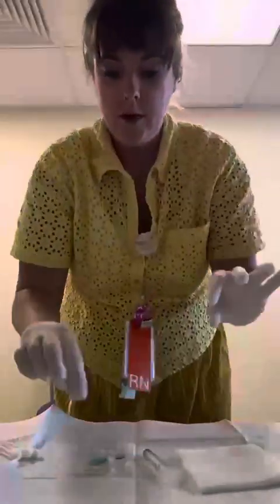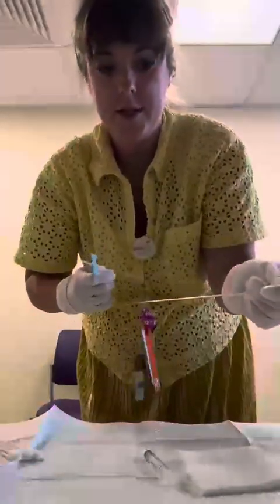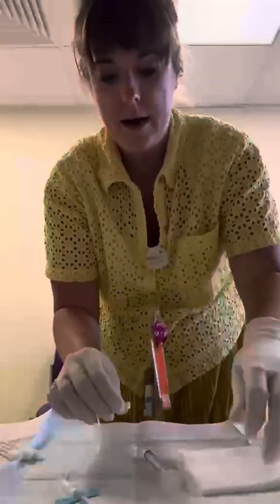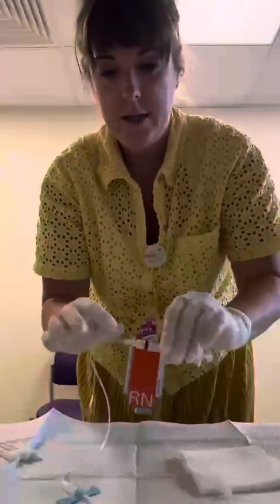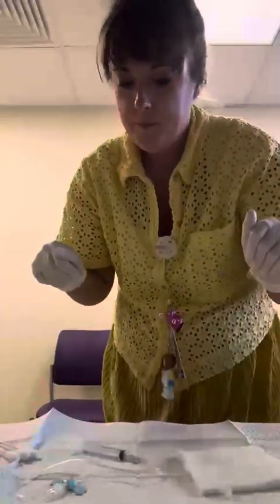Okay, so I'm going to prep my supplies. This comes all squirrely. It's really helpful to stretch this out. That way it doesn't bend at all. And then you can take this cap off. You can connect these 2 things, and then your partner can help hold that for when you're ready.